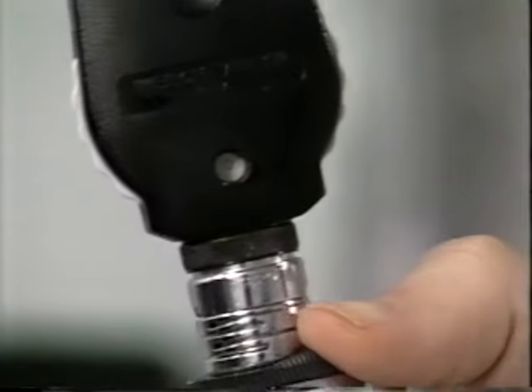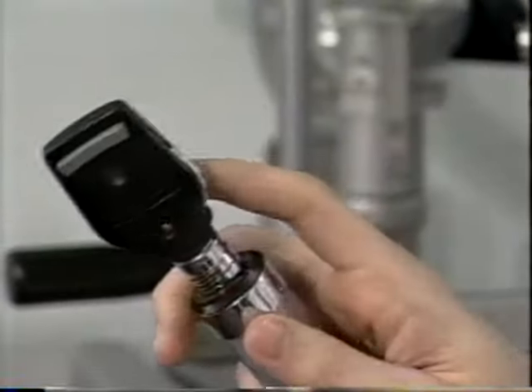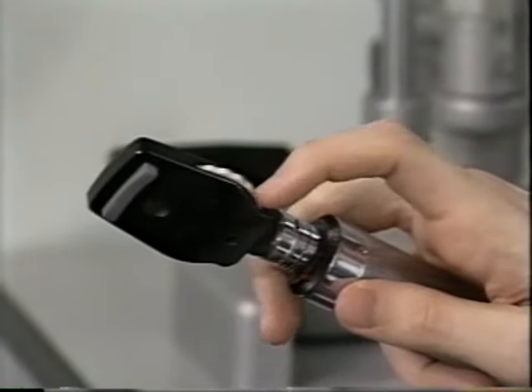Get to know your ophthalmoscope and its parts. This button turns it on and adjusts the light intensity. This dial adjusts your focus.